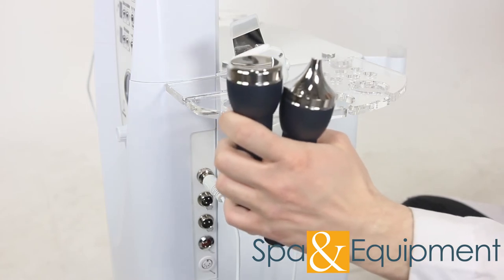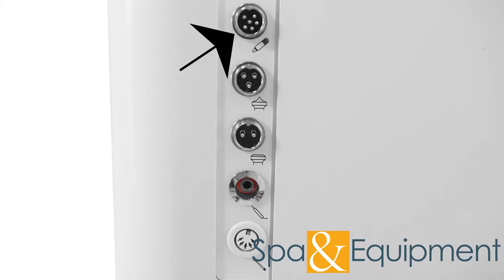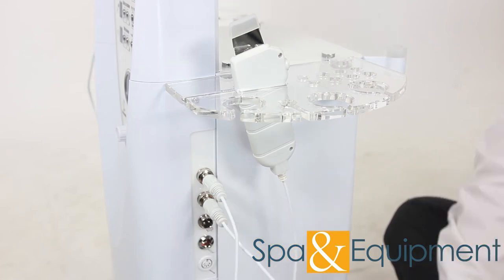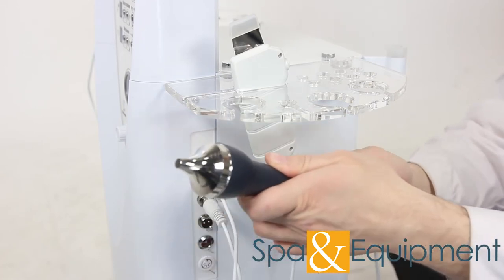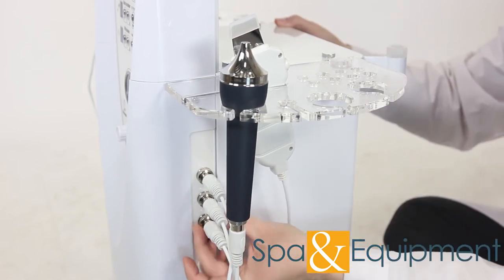The next tools to install are the ultrasonic handles. You'll notice that the cables for the handles are slightly different. Take the cable that has the three-prong female end and plug it in here. Tighten up the lock and plug the other end into this ultrasonic handle. Do the same thing with the other cable and the other ultrasonic handle.